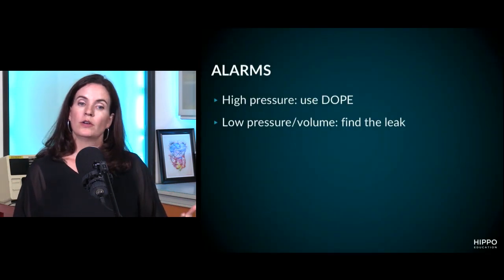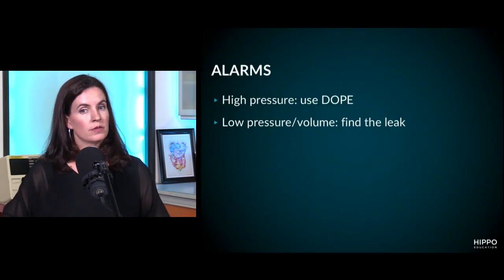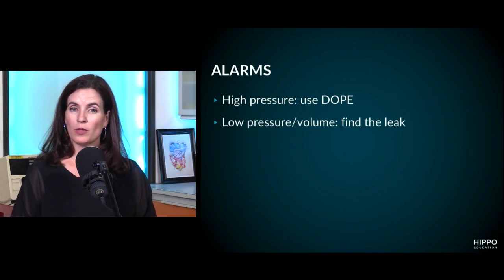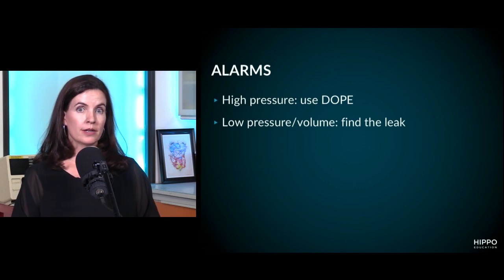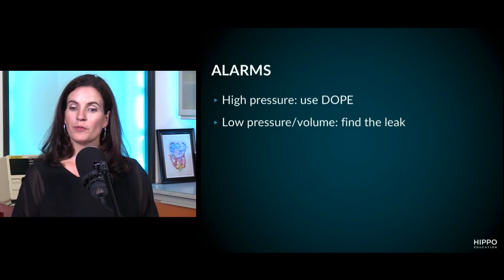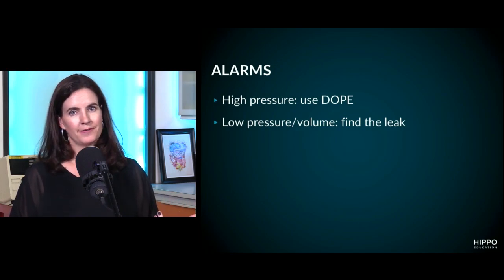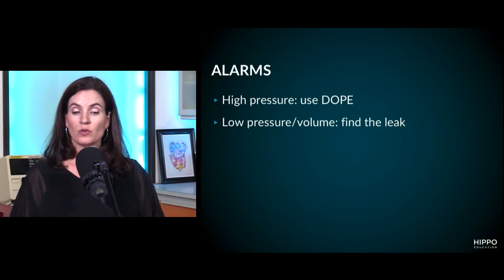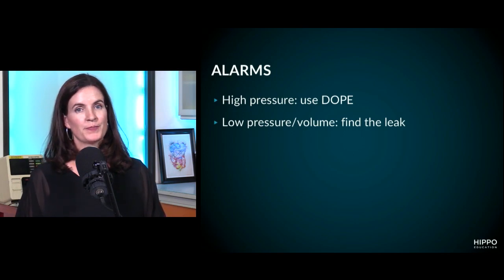So, basic approach to alarms. Step 1 is walk towards the alarm. Step 2 is when you're in the room, silence it so you can think. Step 3 is to read the alarm, so you can tell your RT or you can learn about it. Step 4 is then to fix the easy stuff. Do all of the stuff that's obvious at the bedside that would help your patient. And step 5 is to remember your algorithms for your high pressure alarms and your low pressure alarms.